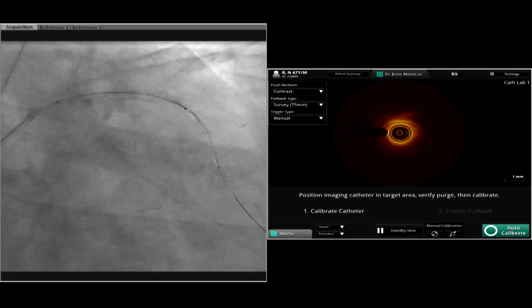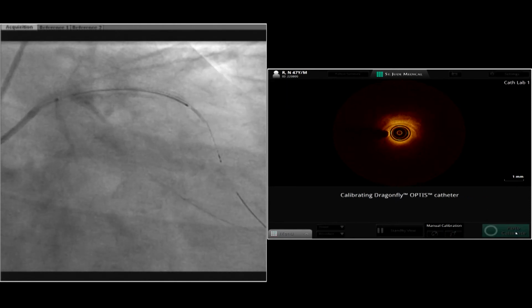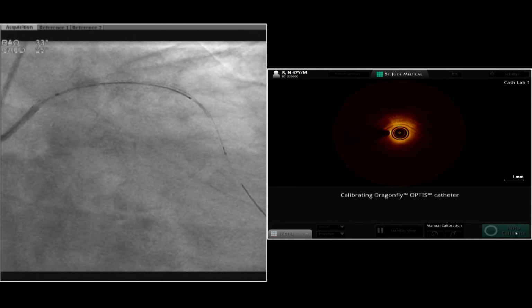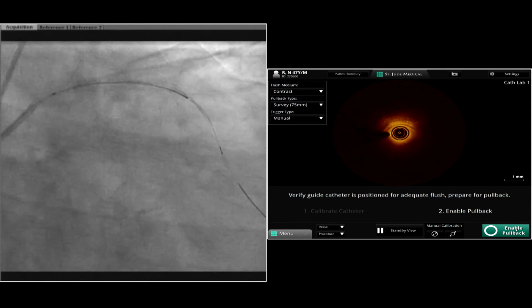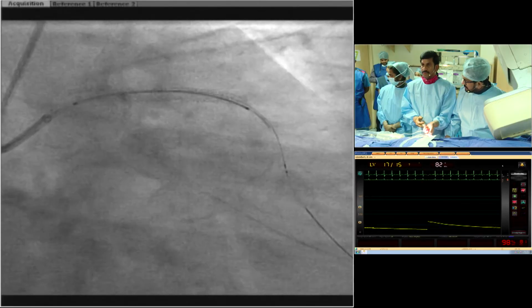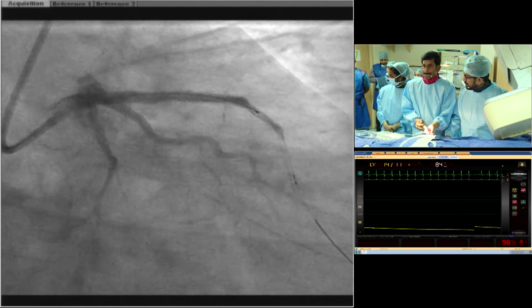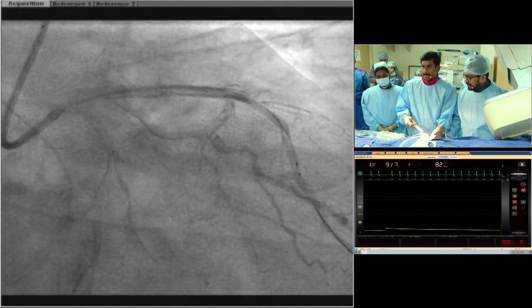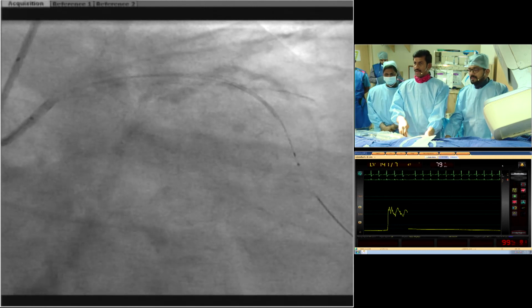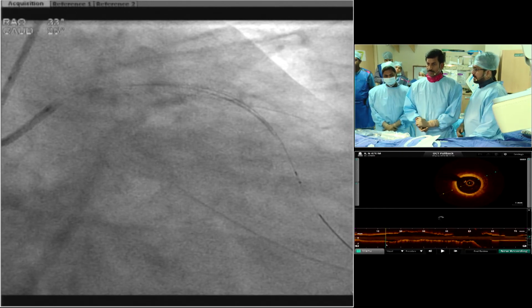His renal function is normal. His LDL is uncontrolled, 130. So that could have been another issue as well. You tell me. Go to PA cranial. Can you show the OCT now?